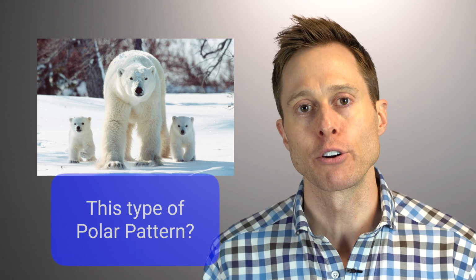In order to perform directionality well, you have to have 2 microphones on each of your hearing aids. Whether this is 2 microphones on an in-the-ear device or 2 microphones on a receiver in canal or behind the ear device. The reason that 2 microphones are extremely important is because it has to do with the timing difference between when sounds hit one microphone versus the other microphone, and then sound engineers can start to control the polar pattern of microphone pickup. Now, I do realize that this is probably the first time that you've heard of polar patterns, but don't worry, I'll explain it here in a minute.